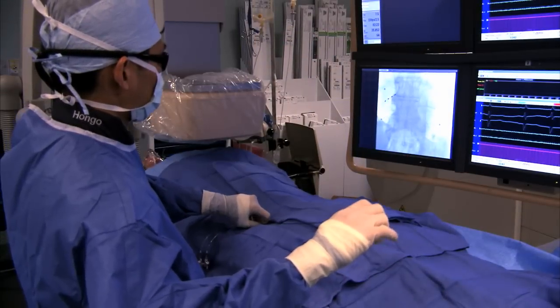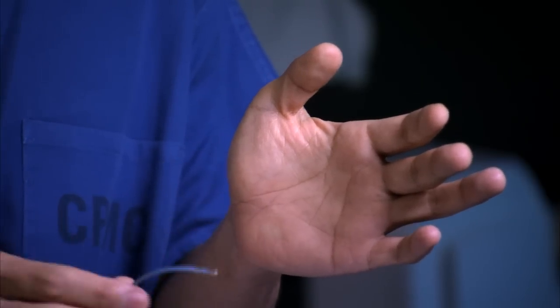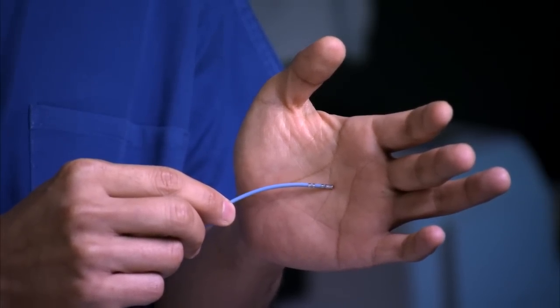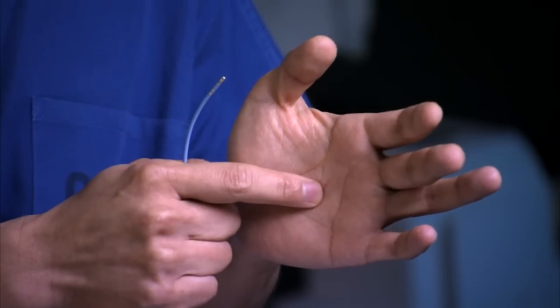So let me explain catheter ablation in a little more detail. If this here, my hand, is the wall of the heart, the ablation itself is caused when the tissue underneath the tip of the platinum catheter electrode is heated to somewhere between 50 to 60 degrees Celsius. Now this in and of itself is not very hot, but when kept on one spot long enough, somewhere between 30 to 60 seconds at a time, that's enough to cause some denaturing right below the tip of the catheter itself. And this denatured tissue stops all electrical conduction. And over a few months' time, this denatured tissue then heals itself into some permanent scar. And this is what keeps ventricular tachycardia from reoccurring.